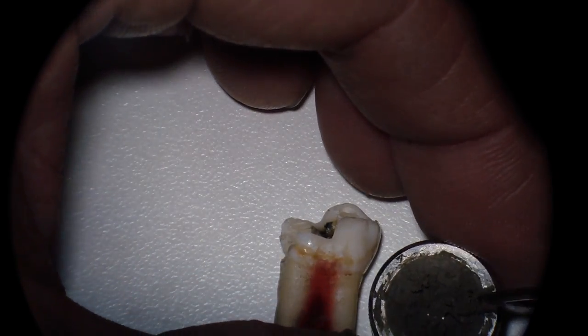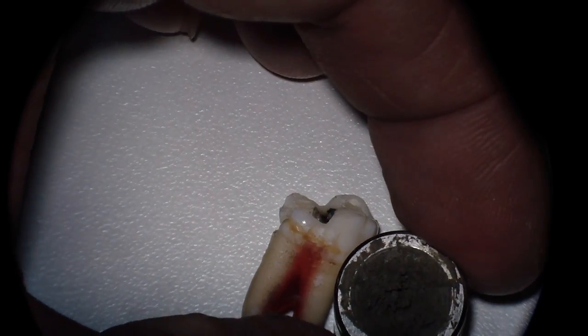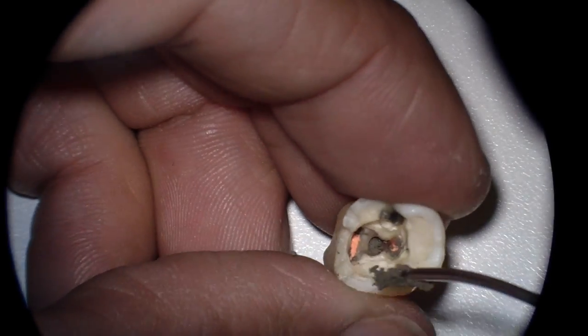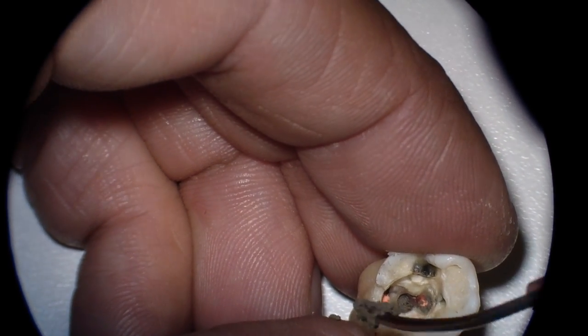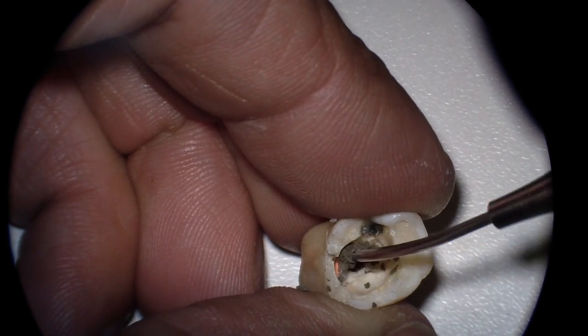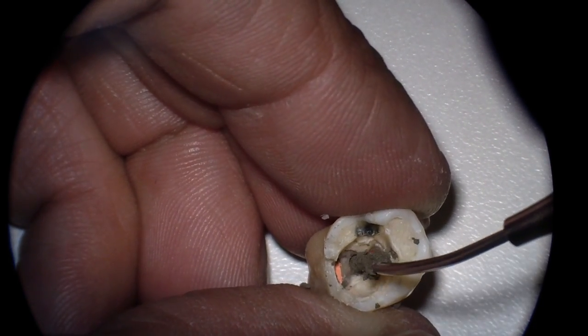One of the things — if you just started the endodontic therapy, well, that's normally where you perf, and your orifices are still open — one of the things you can do is take paper points and place them into the canal orifices. That way you don't get MTA into the canals, making a painful morning even more painful.